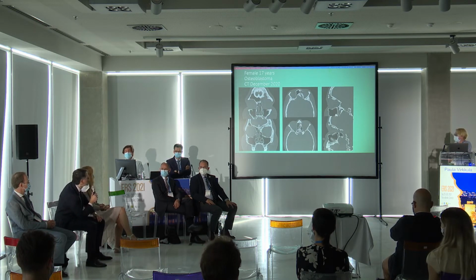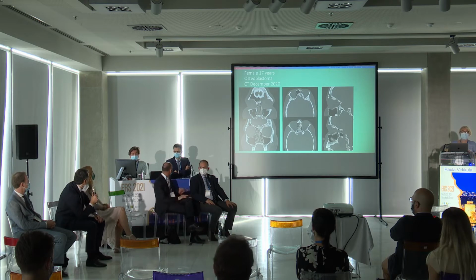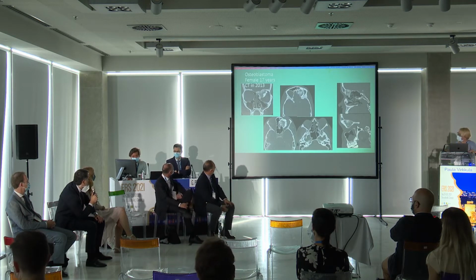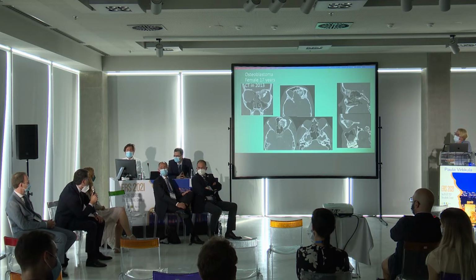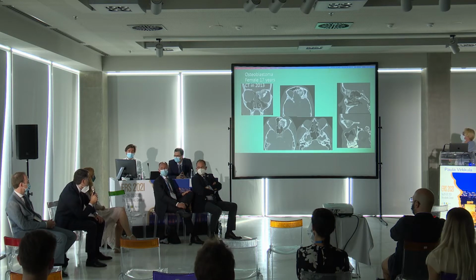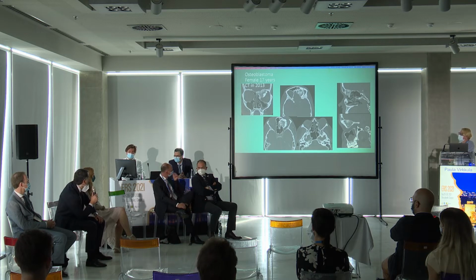So I would like to discuss a little bit the previous pre-op CT scan, if it's possible, so we can talk about indications for surgery. For a situation like this, I would propose to the patient probably an endoscopic resection. I would have the bicoronal approach prepared just in case I'm not able to manage some kind of CSF leak over the orbit, too far lateral, and to do a combined approach after. But the first indication for me would be a transnasal endoscopic approach.